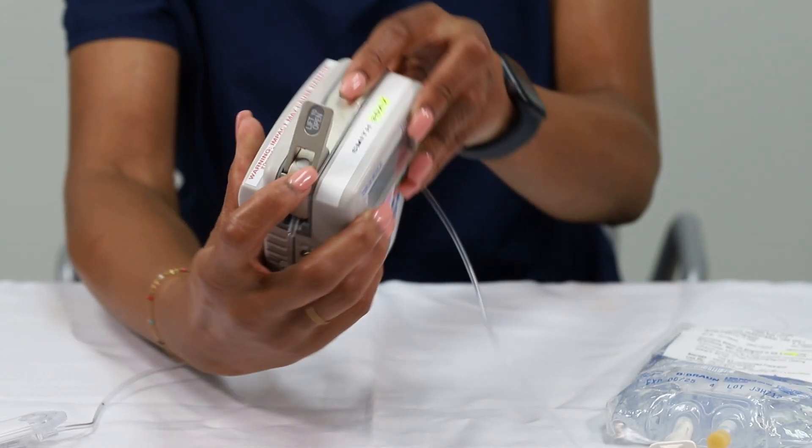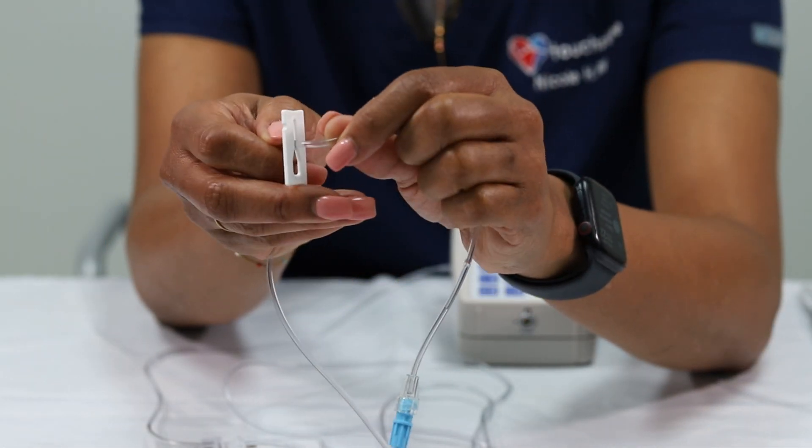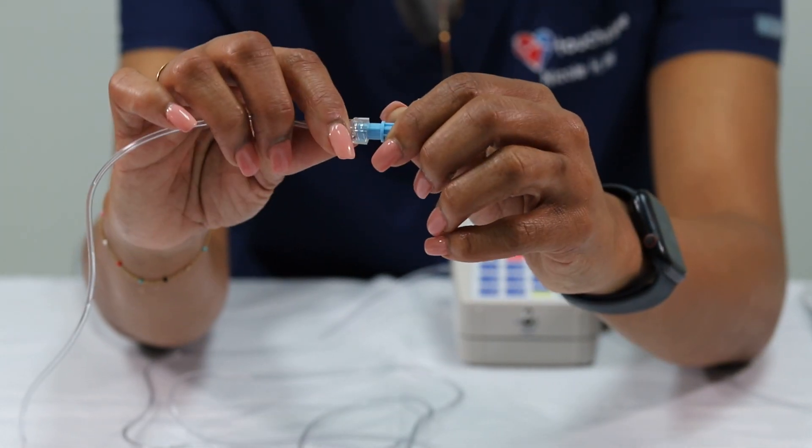Close the lever and press down the tab until you hear a click. Unclamp your IV line and loosen the blue cap at the end of the IV line.